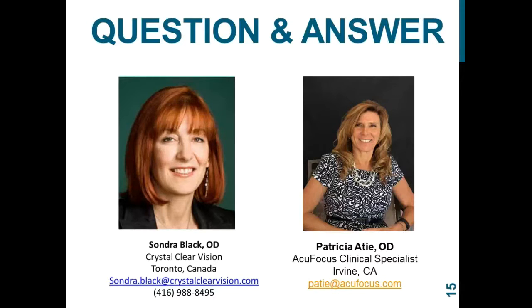Yeah, we haven't done any hunters, so I don't have personal experience on that, but that would make sense because you're right. I do at the slit lamp, if I get a little too close to my oculars, I find I can see it more, so I just bring myself back a little bit. I adjust my distance. Right. Oh, that's a really good point. I'm sure we have a lot of questions around that. So, good advice on that.